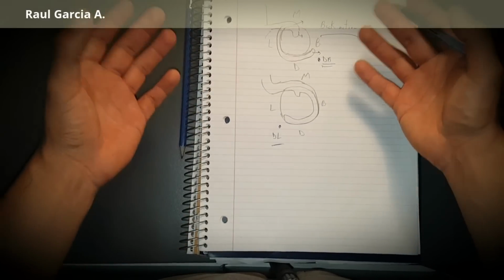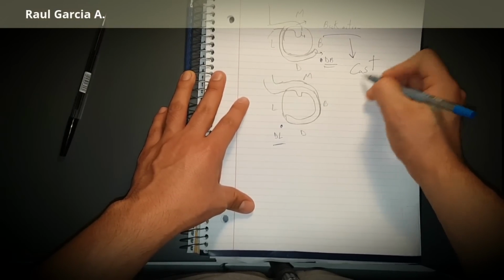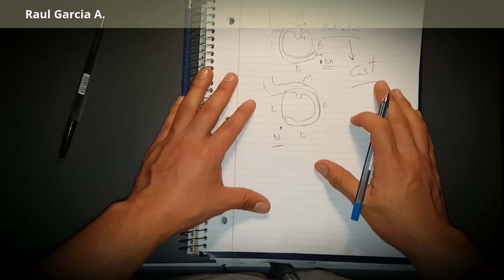action, which is made of which material? Cast. So this is the back action.